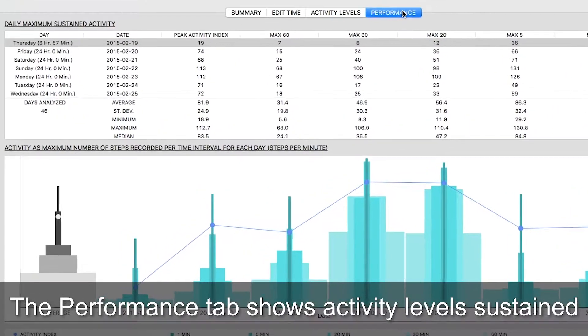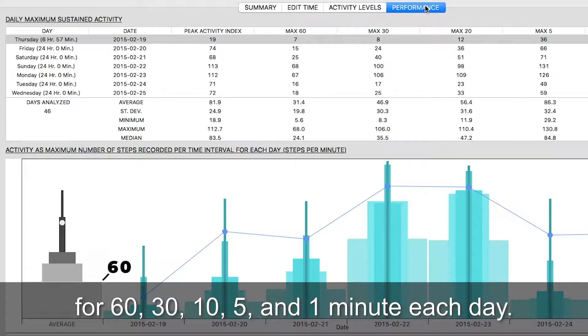The Performance tab shows activity levels sustained for 60, 30, 10, 5, and 1 minute each day.